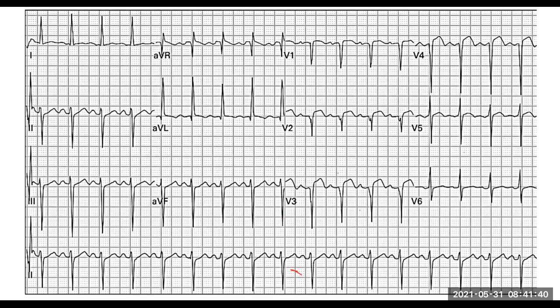we do things like that, but now we're more confident in what we are doing, as compared to just: came in with chest pain, boom, TNT, morphine, send the patient off, send the enzymes off, go to the toilet, because we didn't do anything else, all right? So that's what I'm saying. In a few minutes, we can immediately know what's going on, all right? So your ECG takes 5 minutes, your analysis can take another 5 minutes. Within 10 minutes, you are more confident.